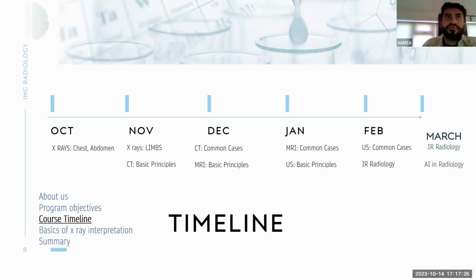You don't necessarily need to know how to interpret these unless you're thinking of specialist training in radiology. But if you are thinking of a career in surgery or any kind of interventional career, it is very good to know how to look at a CT scan. In particular, if you're in A&E and ordering a lot of CT head scans, you should really know how to look at the basic things on a CT head scan. The most common reasons for ordering would be trauma, or a potential bleed or stroke. There are a couple of basic things you may have already studied in medical school, but we'll talk about those in a lot more detail.